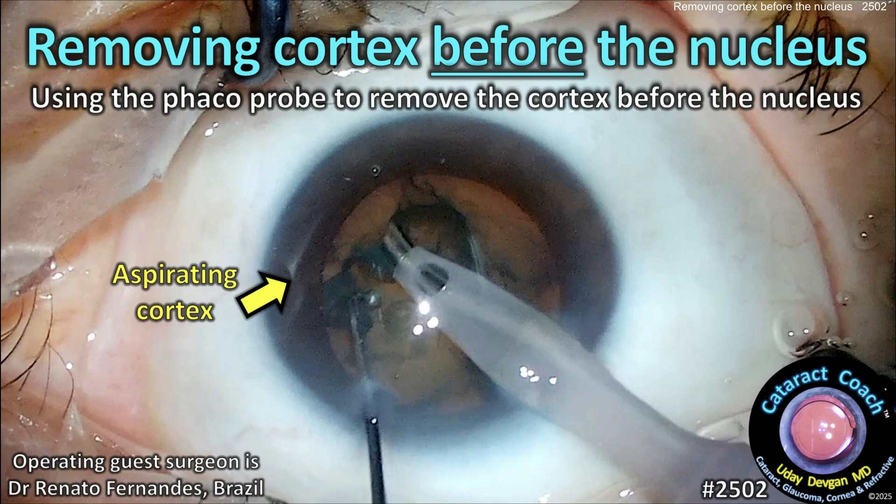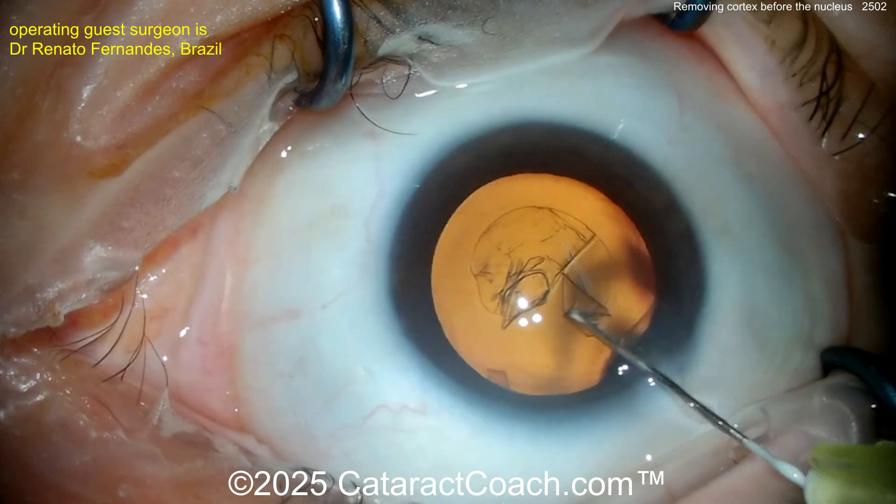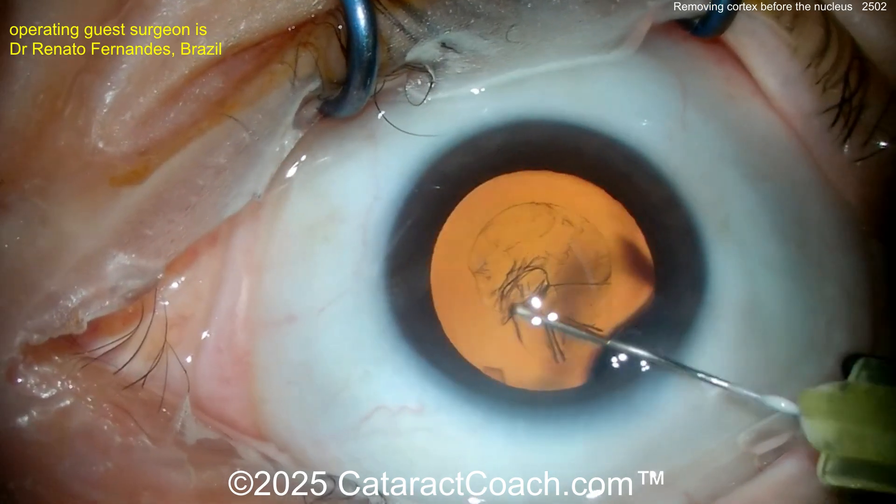CataractCoach.com. Removing the cortex before the nucleus — using the phaco probe to remove the cortex before you start removing that nucleus. It sounds crazy, I know. This is called primary cortical aspiration, a great idea from our young surgeon.